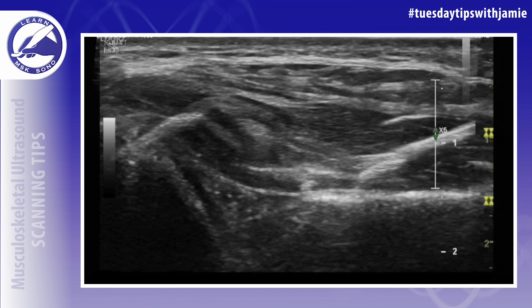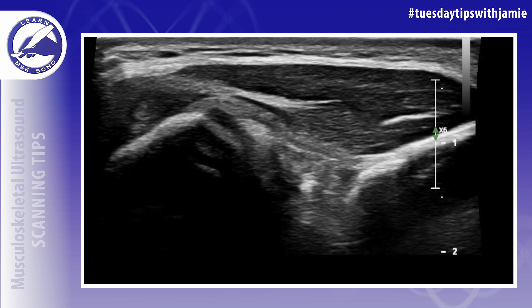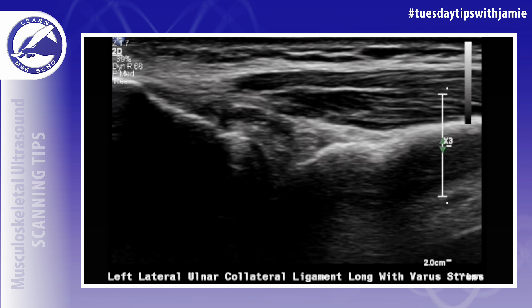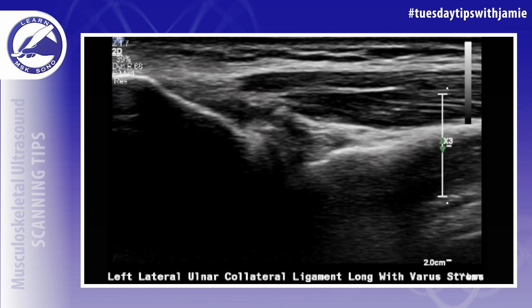The lateral ulnar collateral ligament should be assessed in the long axis from anterior to posterior. When a tear or laxity of the ligament is suspected, dynamic evaluation should be performed using varus stress to check for any stretching or gap in the ligament fibers.